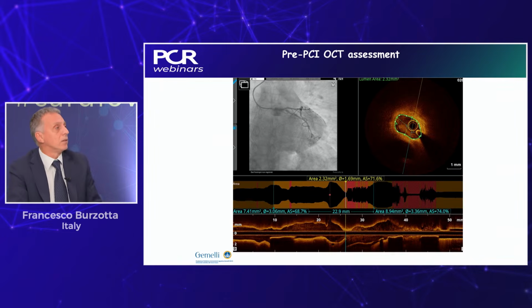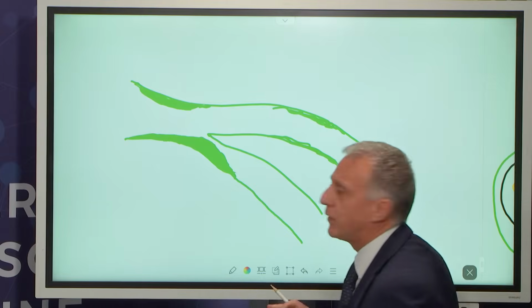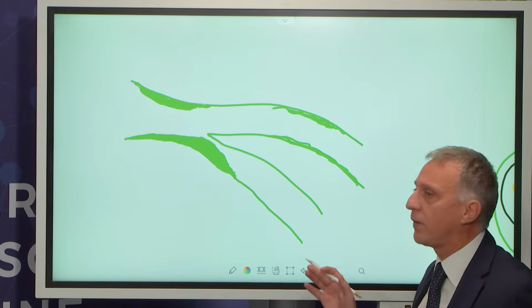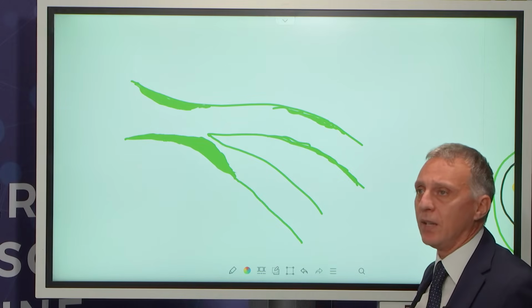Francesco, I think you can show us on this smart board what the plaque distribution was and what the decision making was on how to treat. So I think that only after imaging can you be 100% sure about the distribution of the plaque in your distal left main.